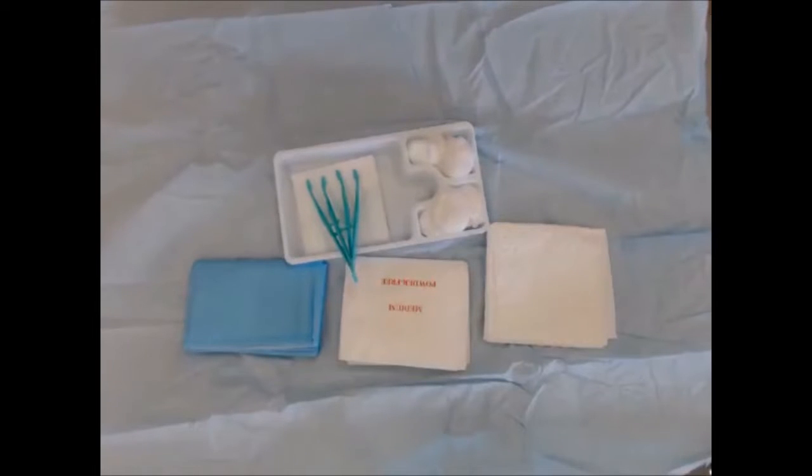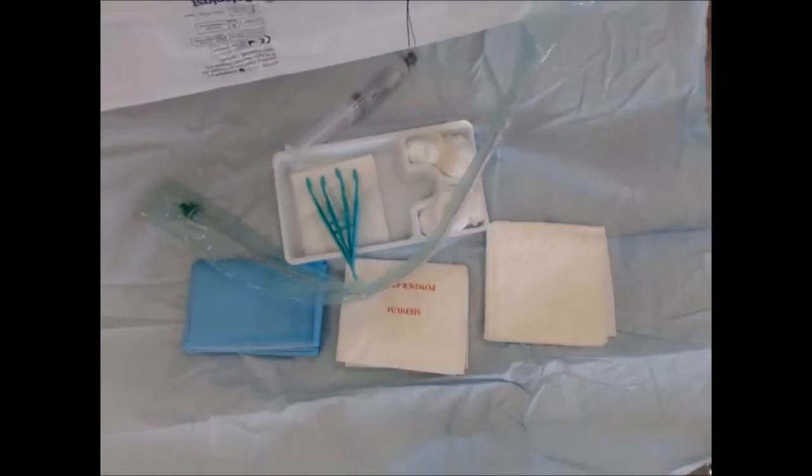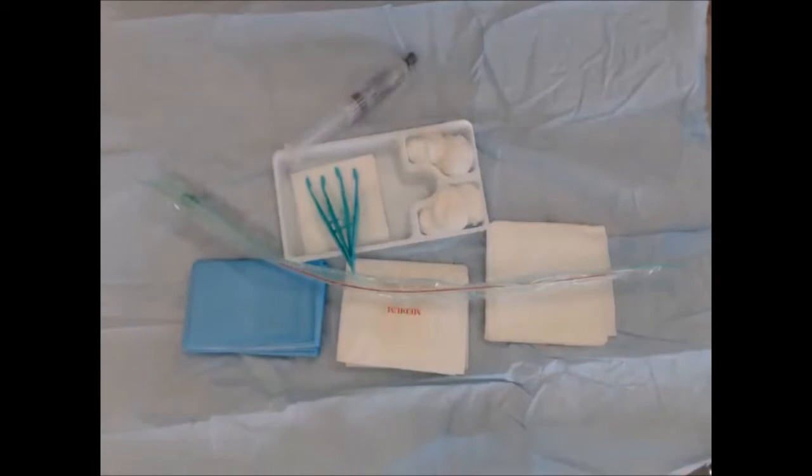Everything else required goes onto the center of the pack, and that includes the catheter. Choose a catheter — usually a size 14 or size 16. Open it away from the sterile field and then place it into the center of the sterile field. This is a silastic catheter, and contained in it is 10ml of water with which you will inflate the balloon.